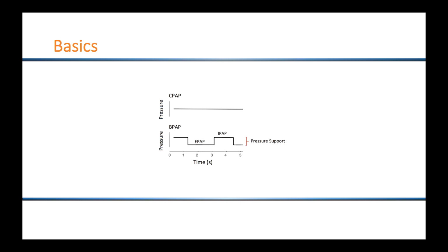Reviewing some of the basic forms of PAP therapy in the ICU, you have CPAP as well as BiPAP. Beginning with CPAP, it stands for continuous positive airway pressure, and as you can see in the diagram, has one continuous pressure throughout inhalation as well as exhalation.